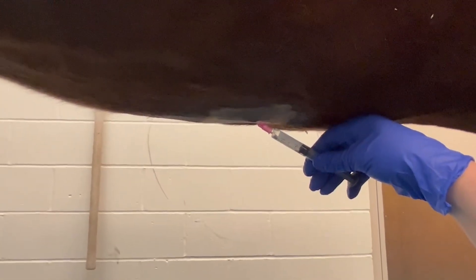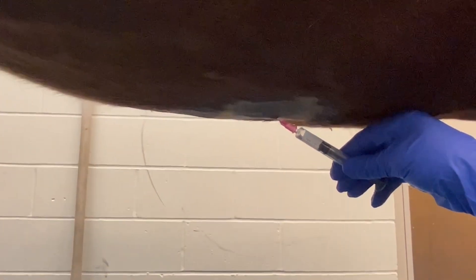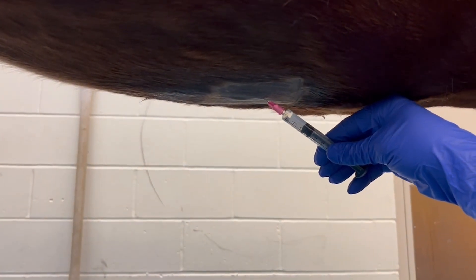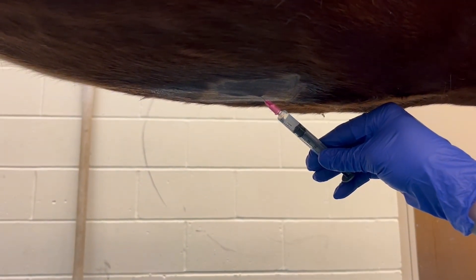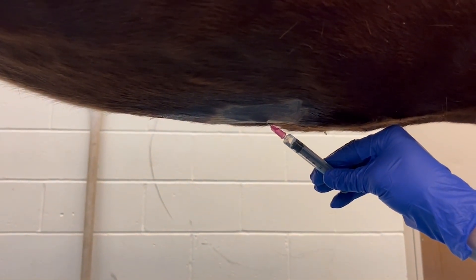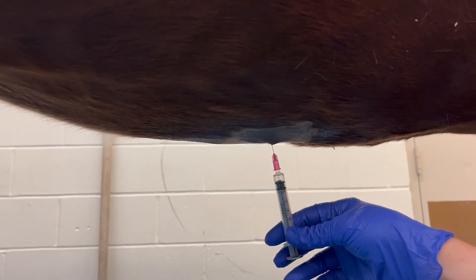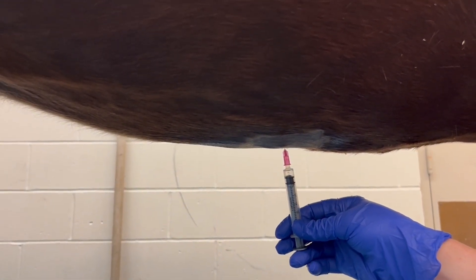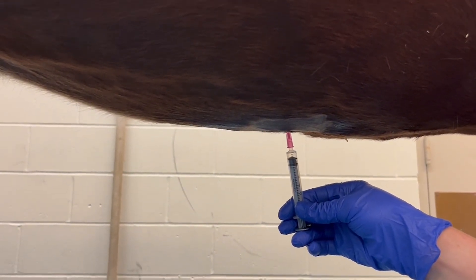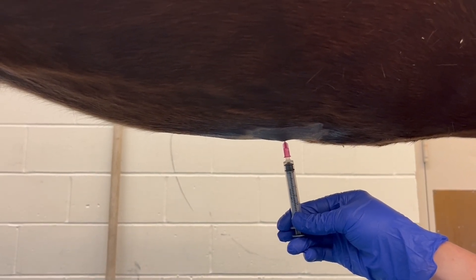One to two milliliters of two percent lidocaine should be administered at the site of the abdominocentesis. Half of this volume should be used as a skin bleb and the needle redirected perpendicularly to desensitize the external rectus sheath. Once the area has been blocked, an aseptic preparation is repeated. Local anesthetic is not necessary if only an 18 gauge needle is going to be used.